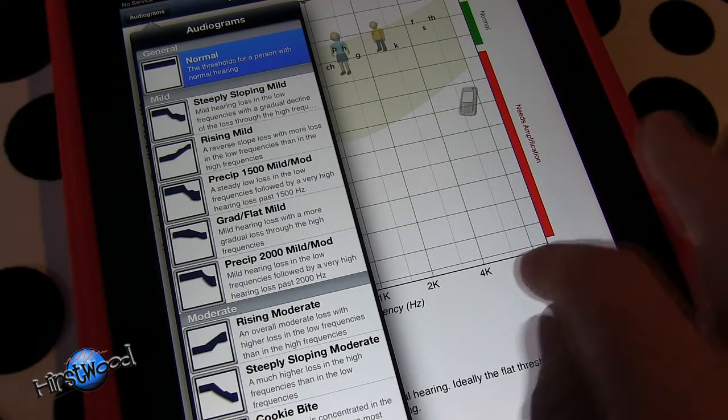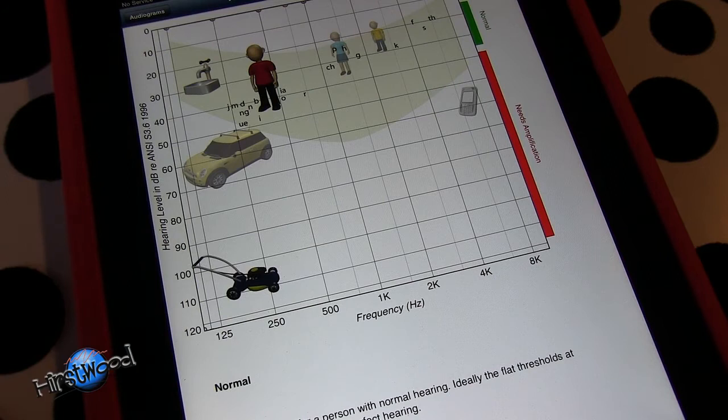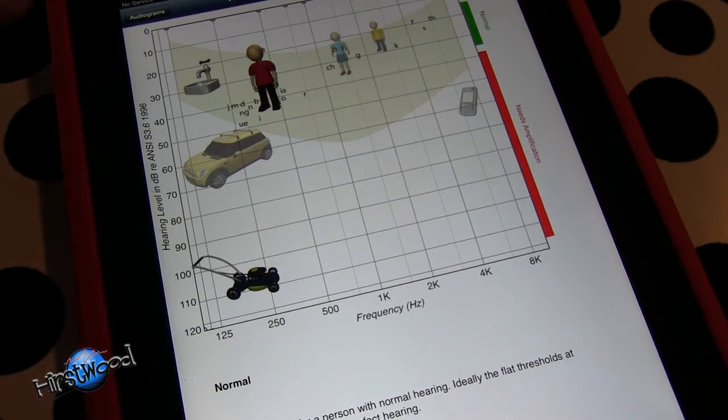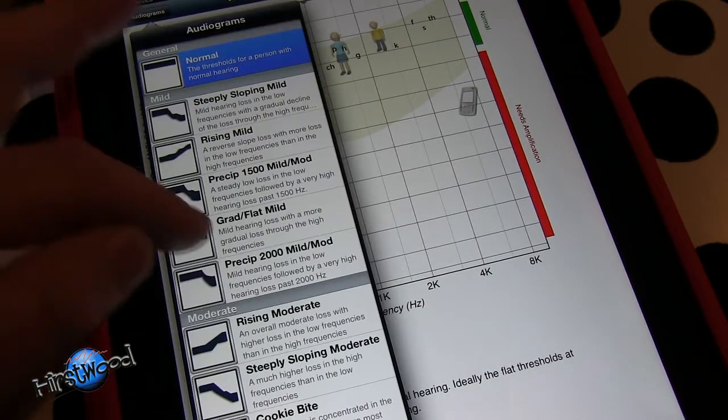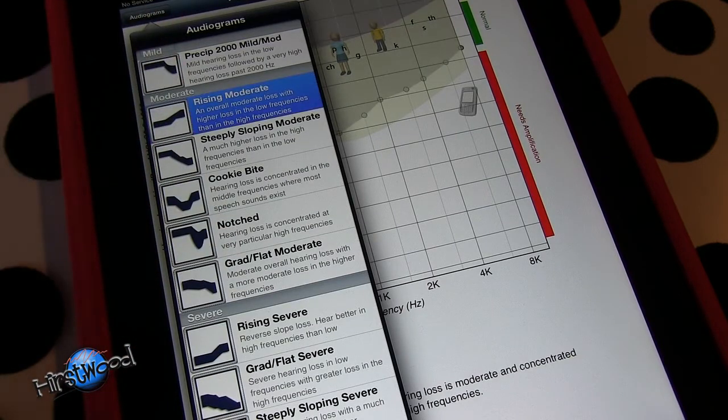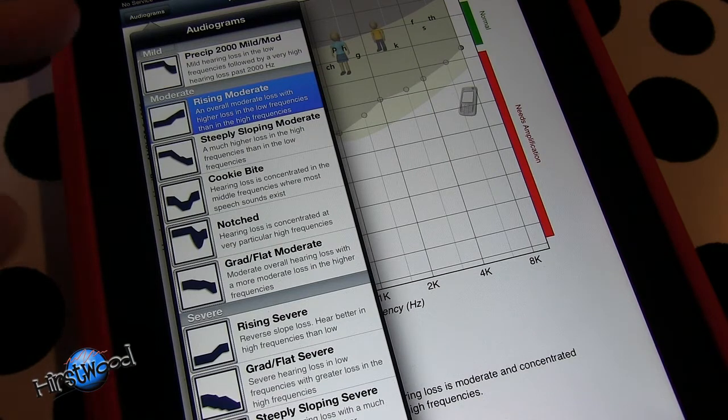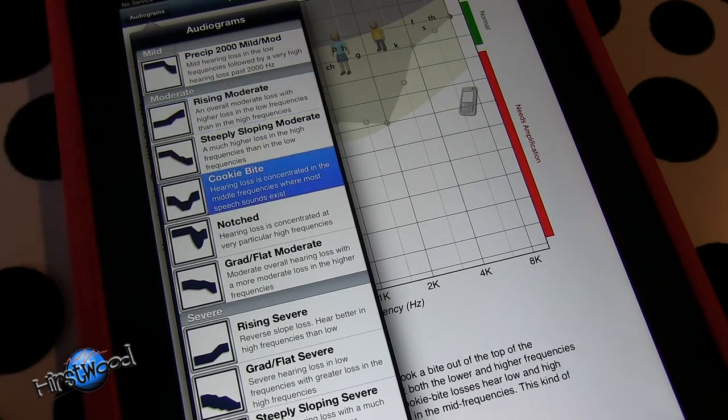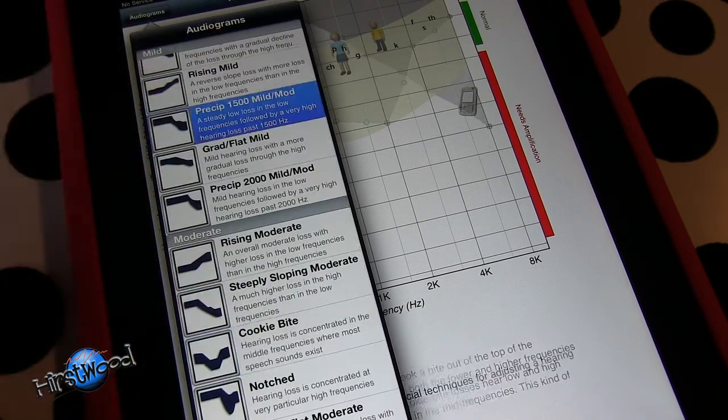A really good demonstration is the lawnmower, which is down here. I've got that going at the moment and that's making it pretty loud. Go back into these audiograms, let's go to rising moderate, and immediately you can tell that's quite a difference. You need to play around with these.